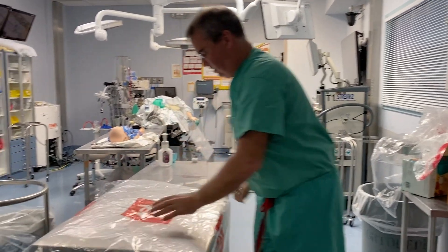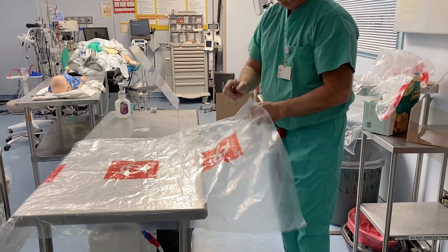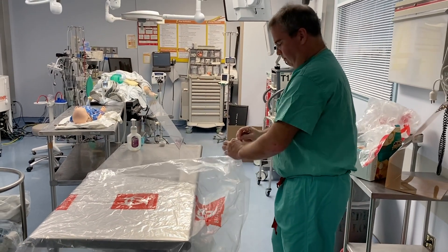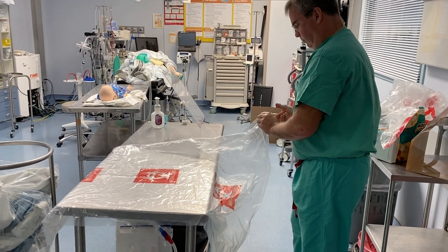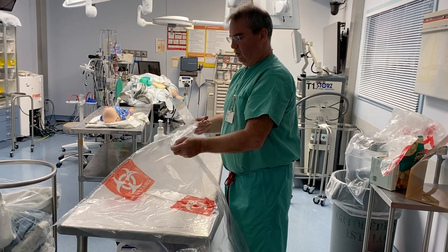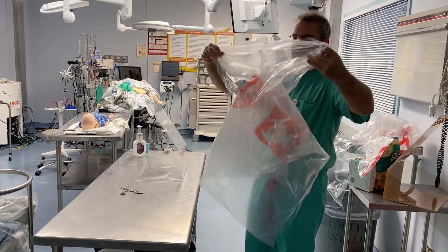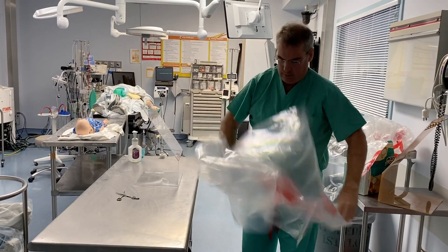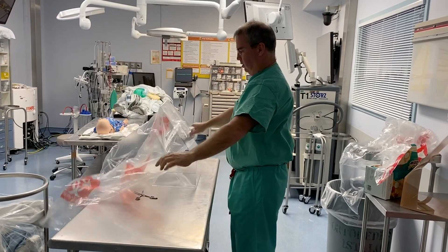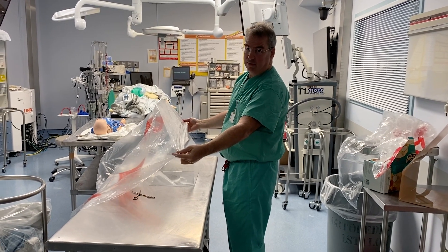I'm going to place the bottom of the bag like this. This would be the top of the bag where we would put things in, and all I'm going to do is cut down one side of the seam. This would all be done prior to taking care of the patient so that you're ready with the shield. I'm all the way down to the corner of the bag, and then I open the bag and place it over the shield with the bottom of the bag and the seams that I just opened up right here like this.